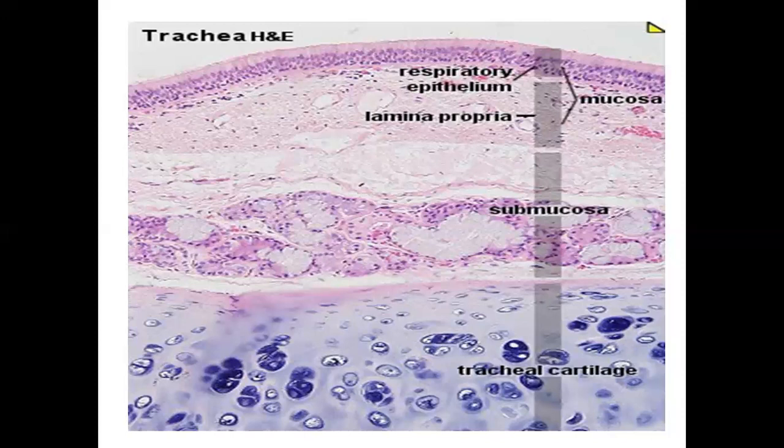بالنسبة للبراش cells اللي هي constitute about only 3% of the total cells. والسيرا cells also make up about 3%. وهذه السيرا الفيتشر مالتها having apical microvilli. تمام. Also having granules when we look at the microscope.